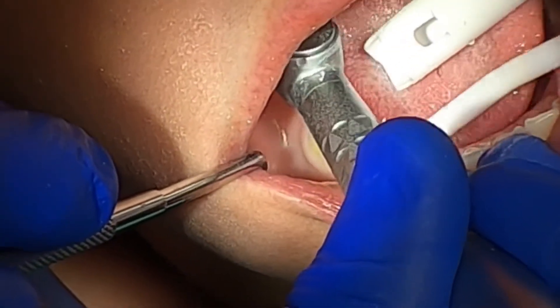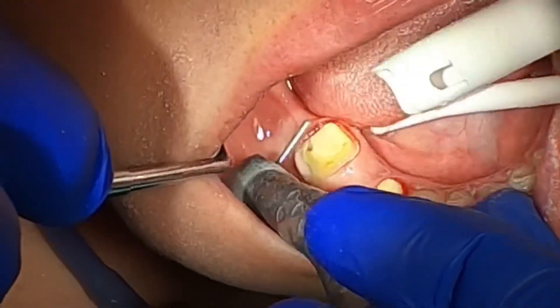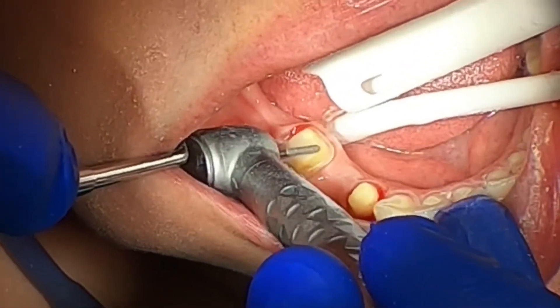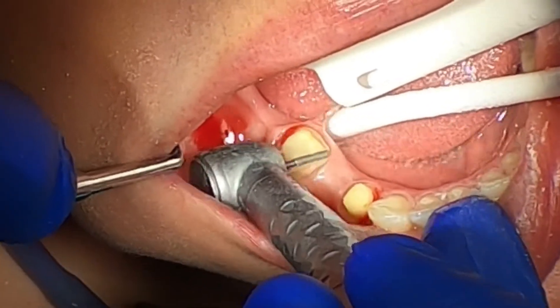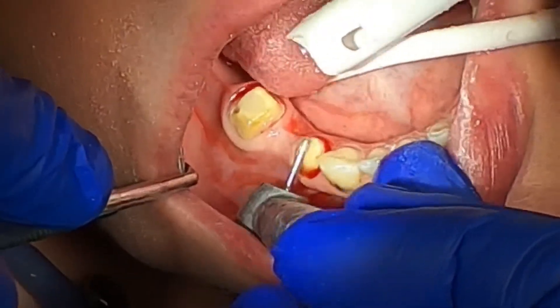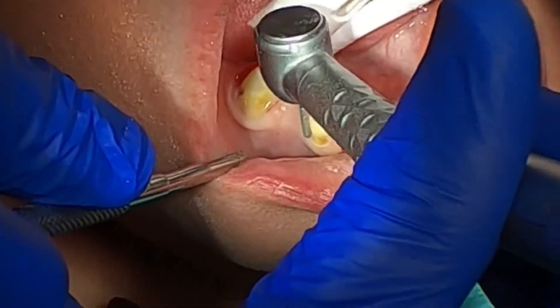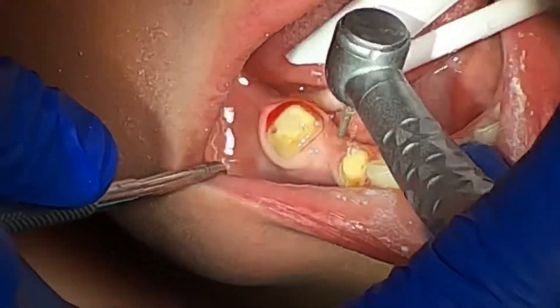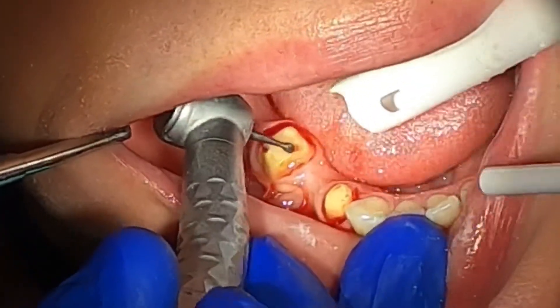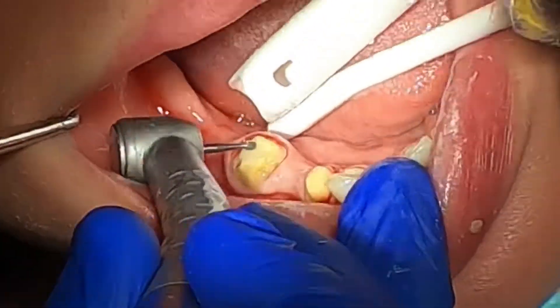It turned out great — a nice opportunity to create a video for you. Hopefully the point-of-view view allows us to see a little bit more, especially for those who may not spend a lot of time doing dentistry or haven't had much experience on the clinical side. Right here you can see some bleeding in the gums — that's fairly common. Gums tend to get angry when you're spinning a handpiece at 5,000 revolutions per second next to them.